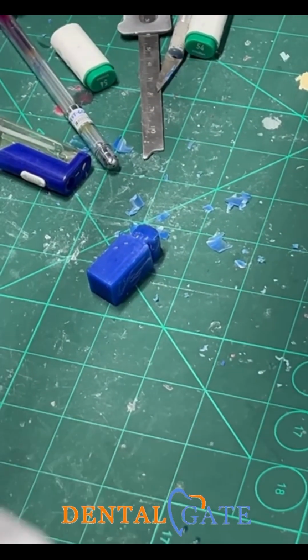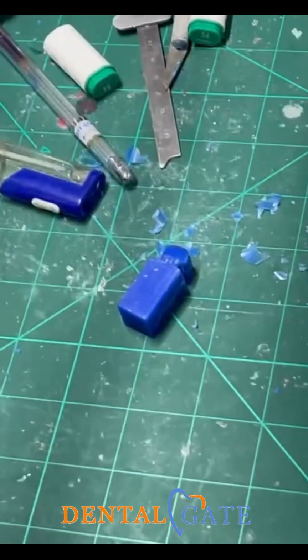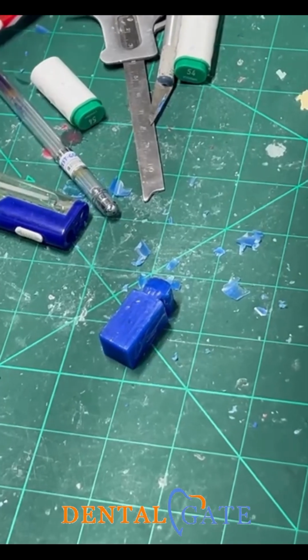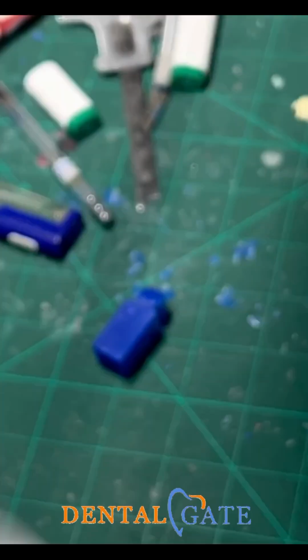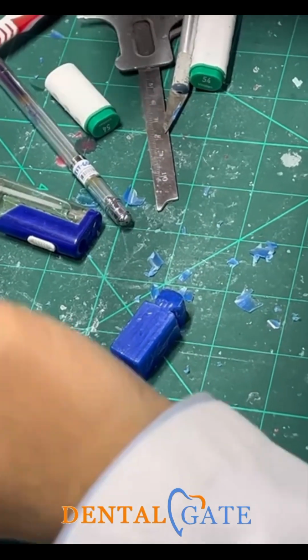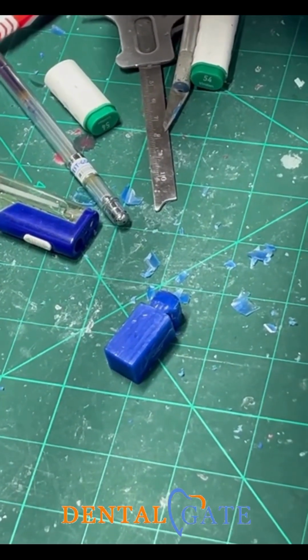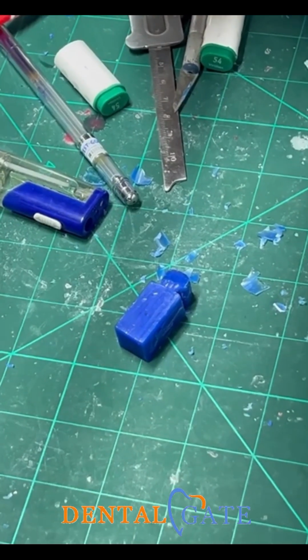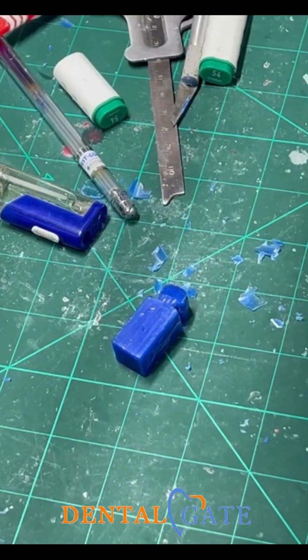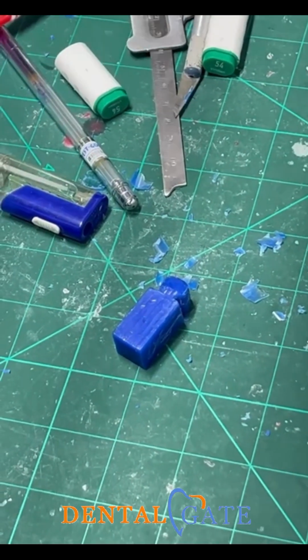So please pay attention to these features, okay? This is the work zone for you. As a technician, this is a work zone. We need a chroma in the cervical third. How can I do it? Because I want to make the curve of the cervical third, and after that I will add the chroma. Because if there is a straight line, I will lose the reflection and the what? Equal reflection and absorption. I need the shape.